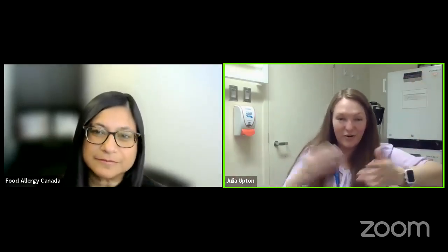And so you don't want to refill these too early, because if your one now is good till December 2024, you don't want to go pick it up now, and it's probably going to be June 2025. So you do want to time it a little bit, and you can definitely ask them to give you one with a decent expiry date on it.